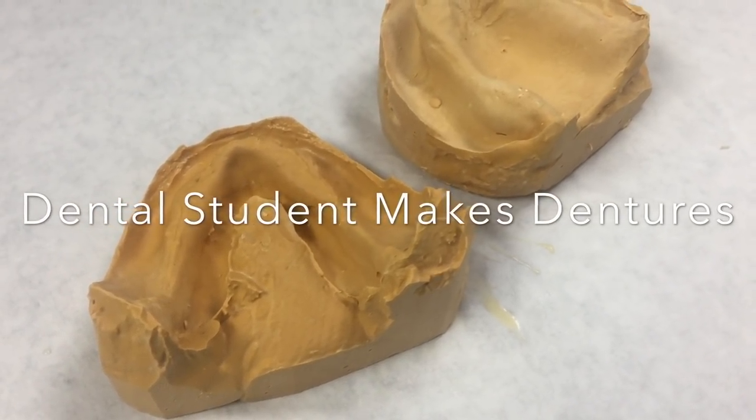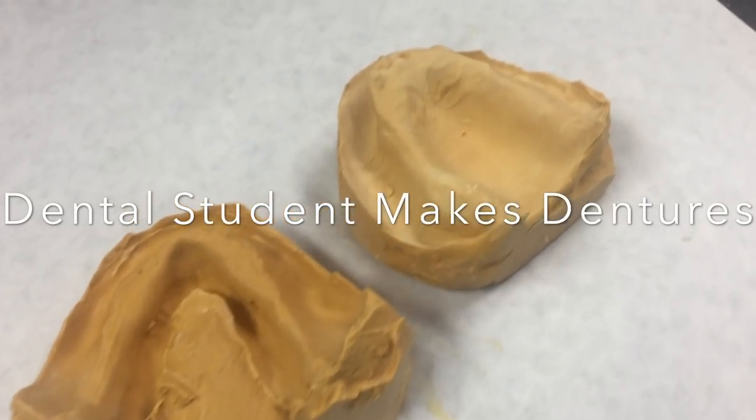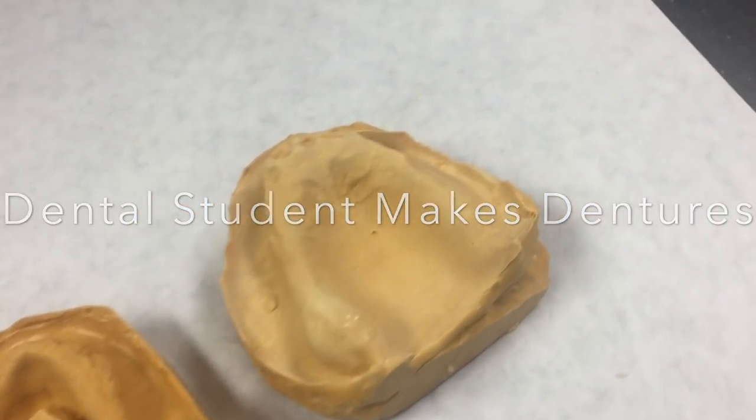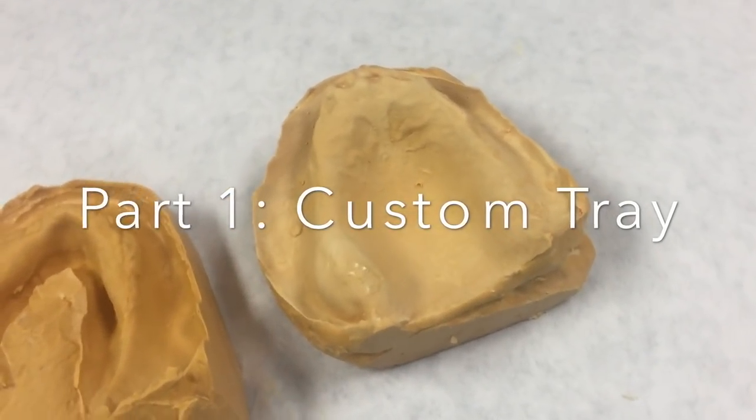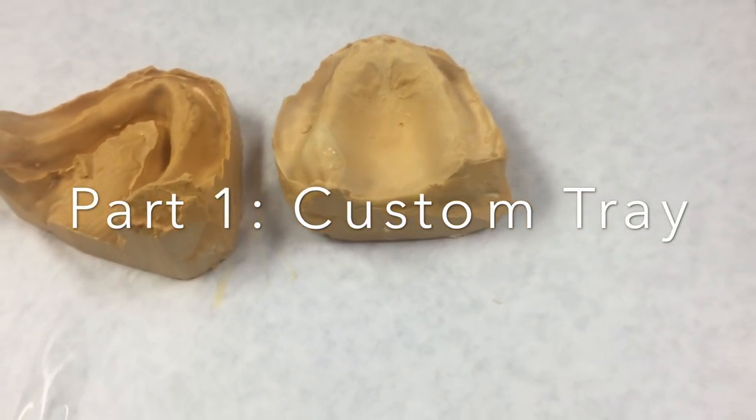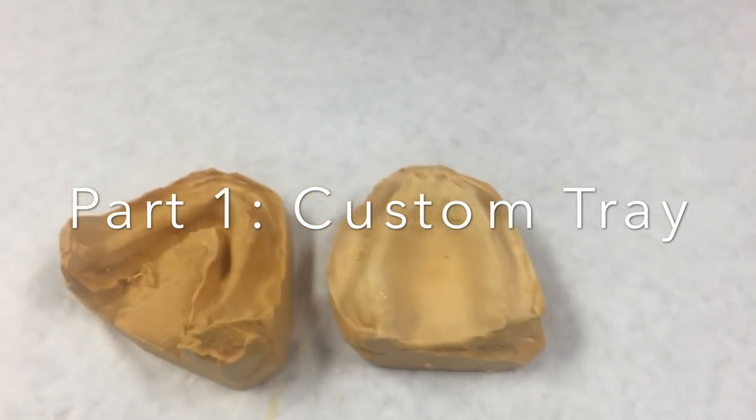Hi everyone, it's Brittany, and today I will be sharing with you a very long overdue video, which is part one of the denture videos. It's in many parts because making dentures takes a lot of steps, so this is the first step: the custom tray.